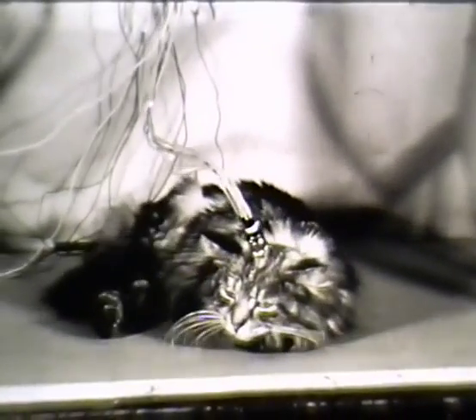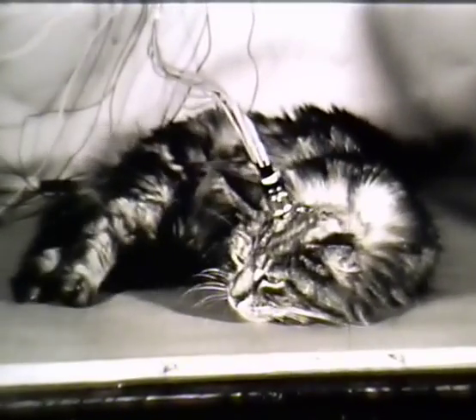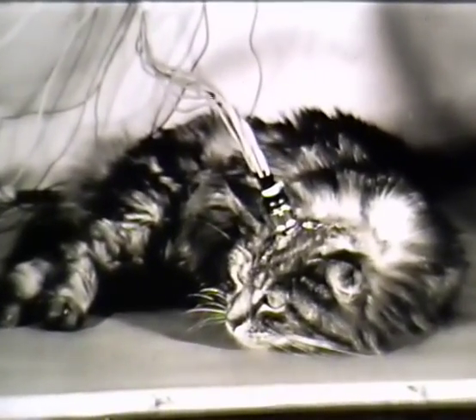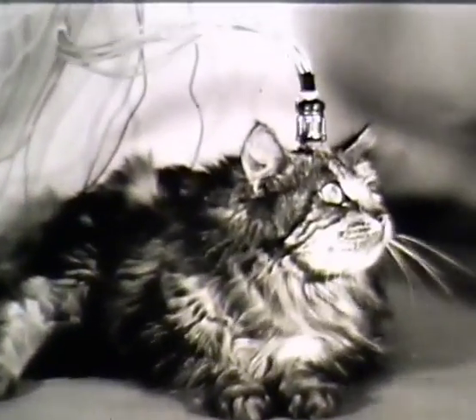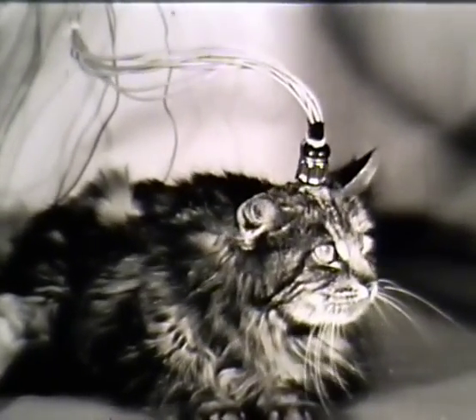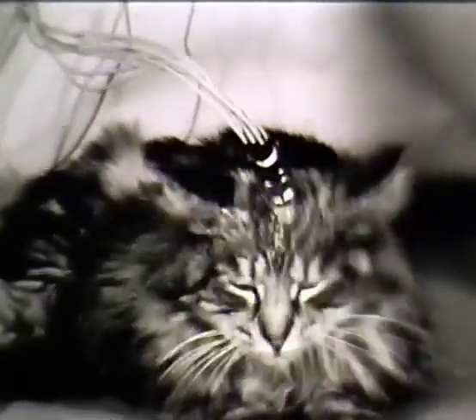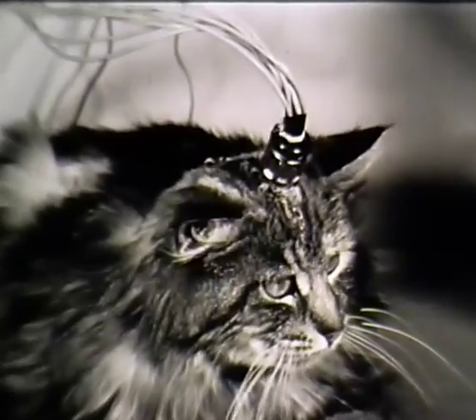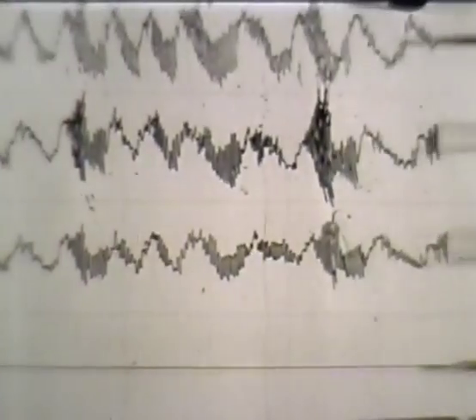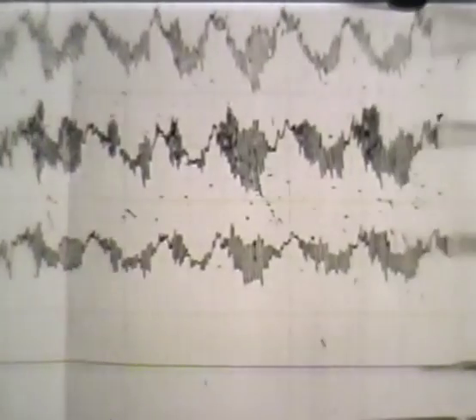The electrical activity shown here was recorded from the olfactory bulb and cortex in cats. We begin with conventional techniques using implanted electrodes. Electrodes are placed for bipolar recording across the dipole field in the olfactory bulb and the dipole field in the olfactory cortex. The electrical activity consists of bursts of sine waves at approximately 40 cycles per second. Each burst occurs during inspiration.